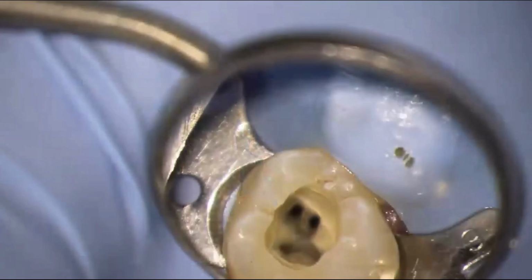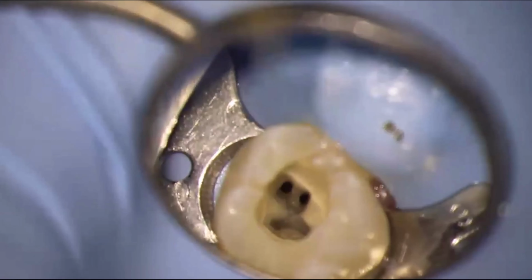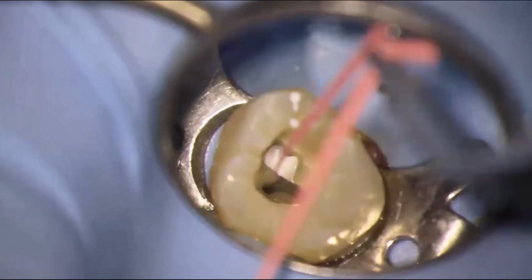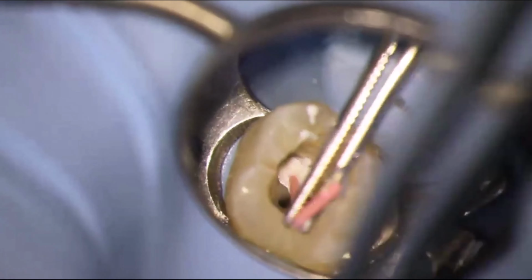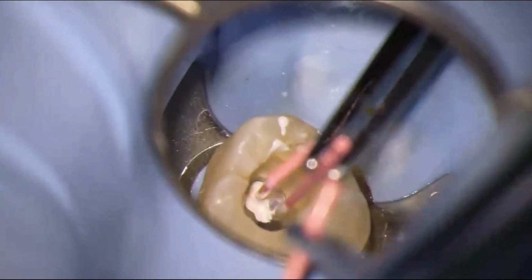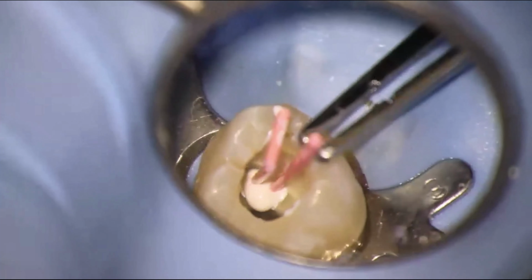So this is just post endodontic instrumentation, Gentlewave, et cetera. We're ready to obturate. So I'm placing the sealer. You can see there was some confluence there. Seating the cone, we're out. Put a little more sealer. Place the cone back, done. Now we're going to put MB2 in. We're out. Put a little more sealer. Cone goes back in. There you go.